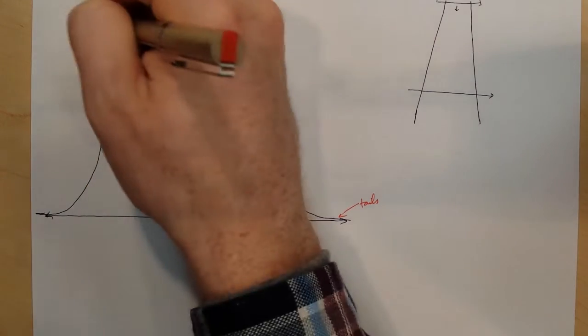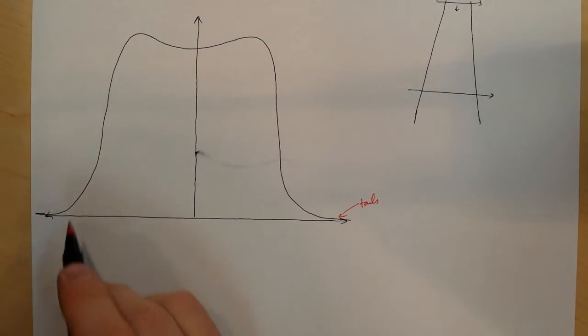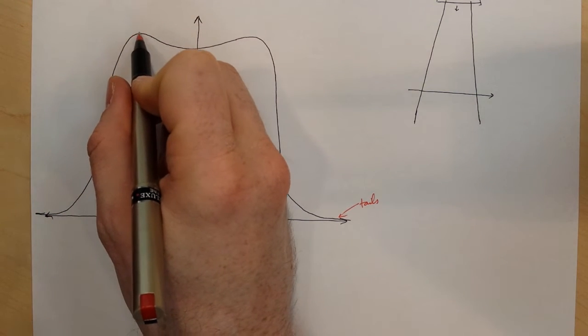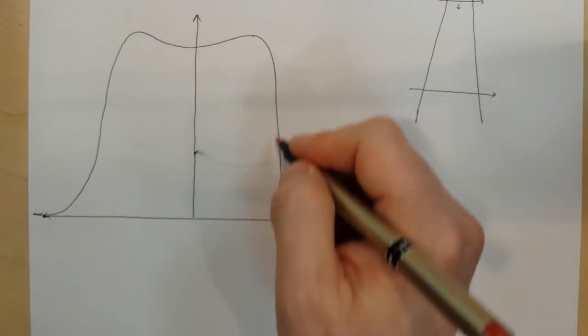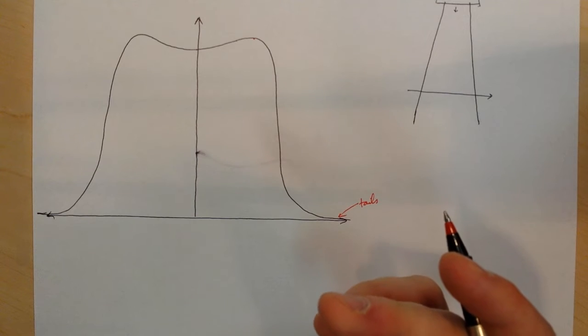It doesn't go straight up, straight over, straight down. The beam does not look like that. We're limited to the laws of physics. We curve up, I come up over a shoulder, dip down in the center, come back up to a shoulder, and I get the same thing on the other side if our beam is symmetric and flat.